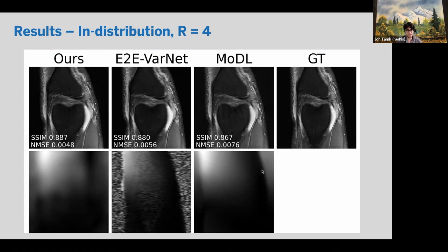That's why you can see in all of these sensitivity maps, we explicitly allow for non-zero components outside of the field of view so that we don't artificially hurt the quantitative metrics. But in practice, it's not actually providing any value to the image reconstruction. In particular, we could reduce the noise of our reconstruction if we explicitly set those background pixels to 0, but we won't get a good quantitative metric on these open public data sets. So that's one reason that we don't do that.